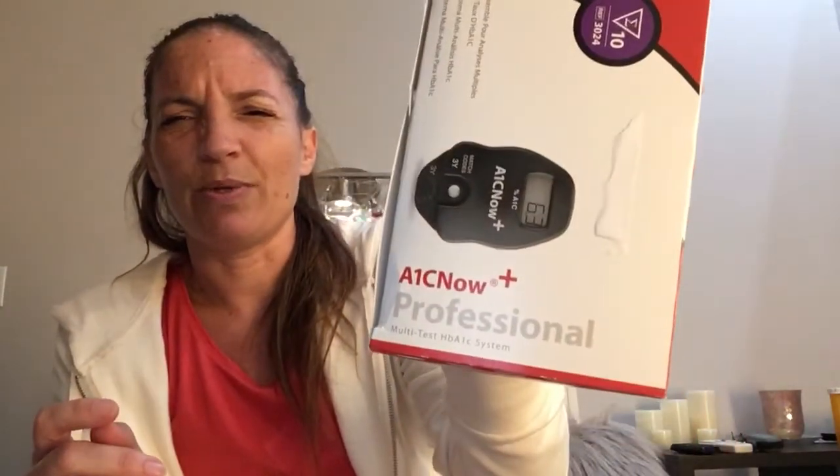Since I was going to do this anyway, I figured I'd go ahead and try to do it here, because some people ask how long does it take and can you do it by yourself. So here's a demonstration. These are the ones I order — this is the A1c Now Professional, the multi-test HB A1c system.